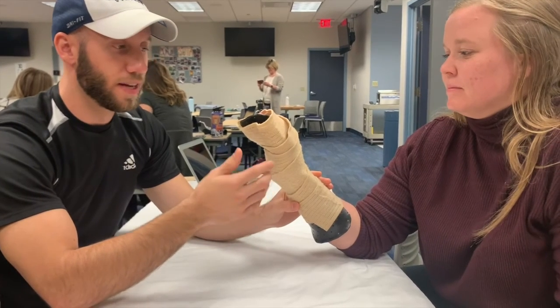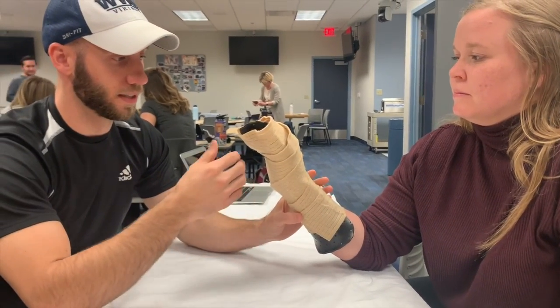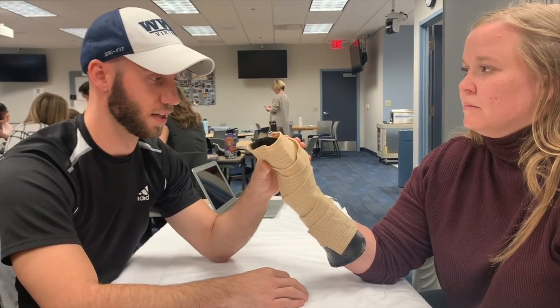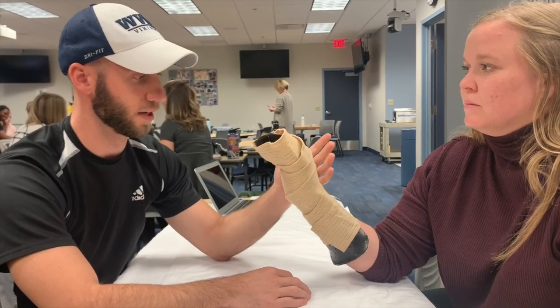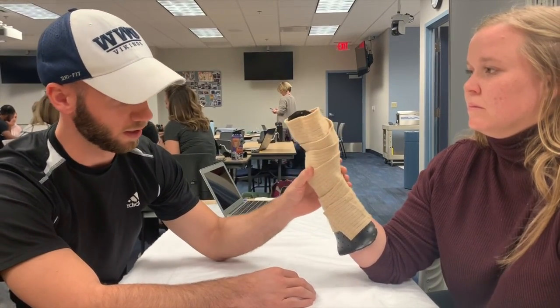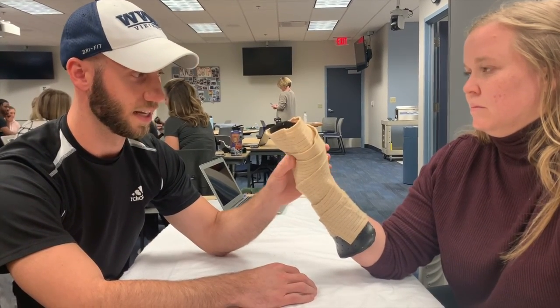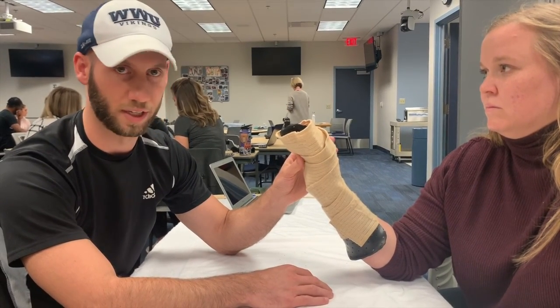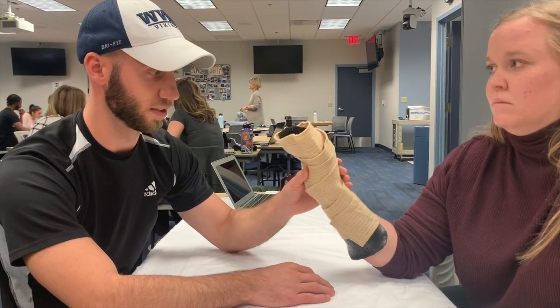So just to reiterate, the wearing schedule is going to be day and night, and this is going to help prevent the skin from tightening and causing contracture of any of the joints as the skin is healing from the third-degree burn. We're also putting the client's hand in an intrinsic plus position, and this is to prevent any contractures as well due to the shortening and tightening of the muscles. So this is in the best joint position.